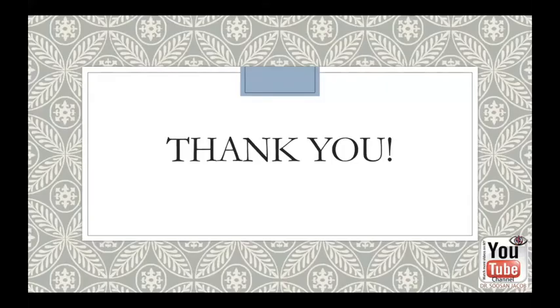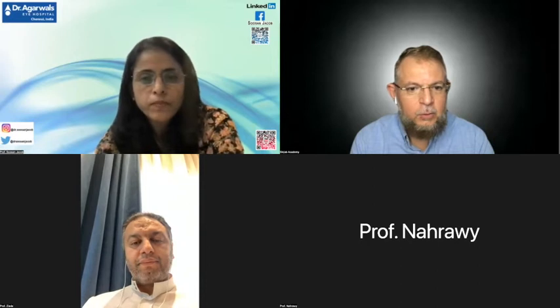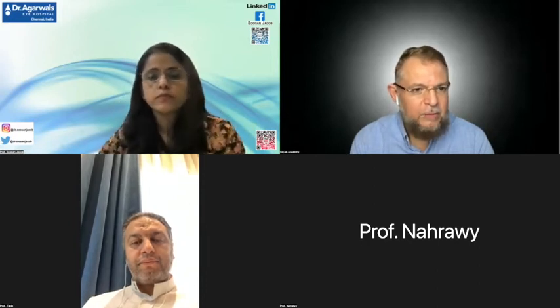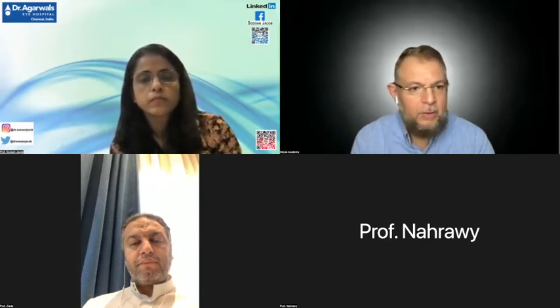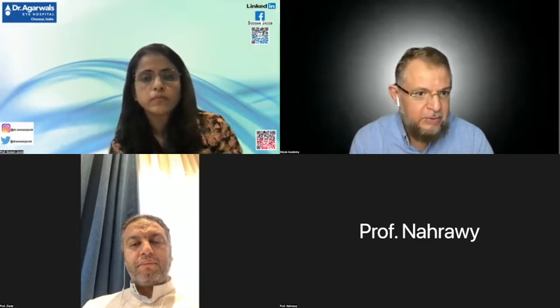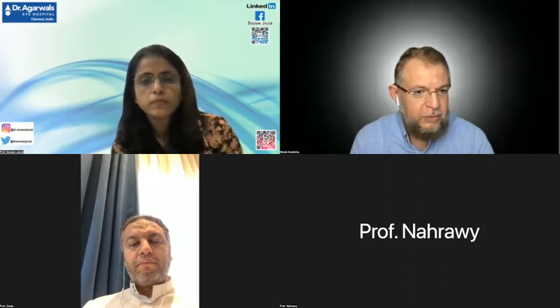Thank you very much, Soosan, for this very nice presentation, and congratulations for this amazing innovation. Actually, it has changed the way of approaching keratoconus in total. And now, of course, I'll open the discussion, and I will start with my question. I think now we can do it for children even, because whenever we face a keratoconus case in children, we hesitate a lot to implant the synthetic intracorneal ring segments, because of rubbing, for many reasons. But I think it's not the case with the CAIRS. We can implant it in children very safely. Am I right?